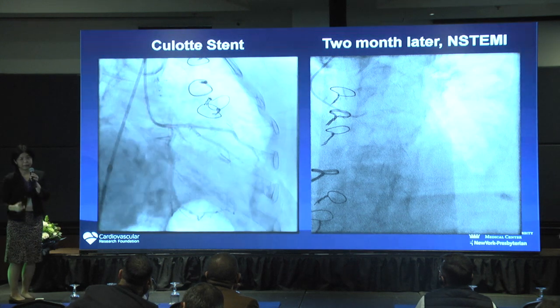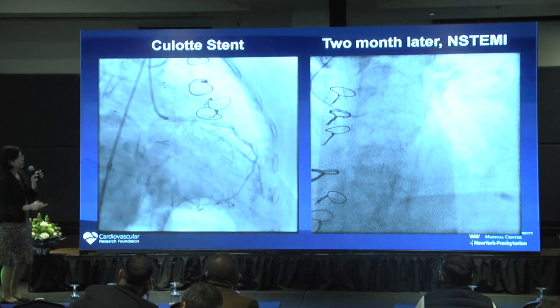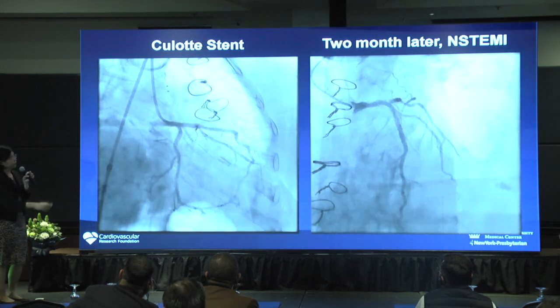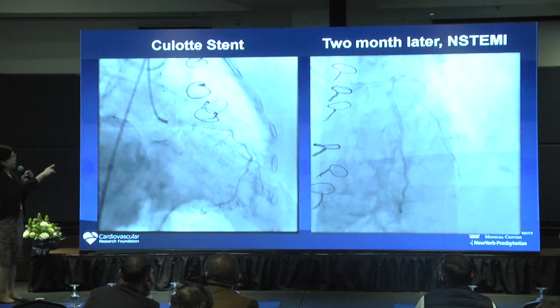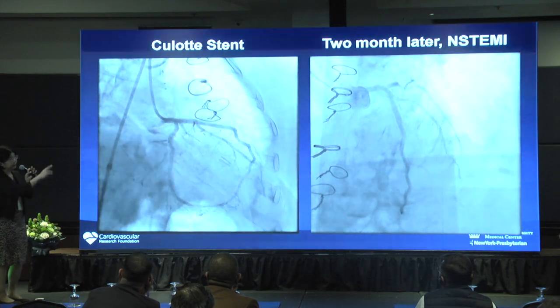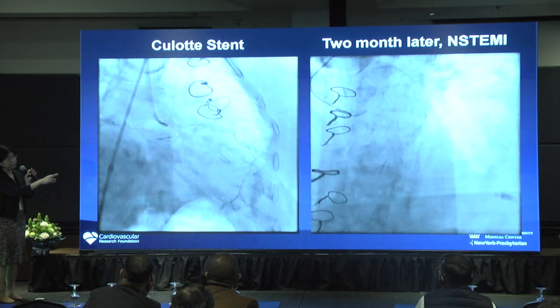Okay, I think I have probably one or two cases, then finish. So this is a case. I didn't show the original picture, but this is where we did the culotte stent. This is a different case. However, the patient came back 2 months later with non-STEMI.